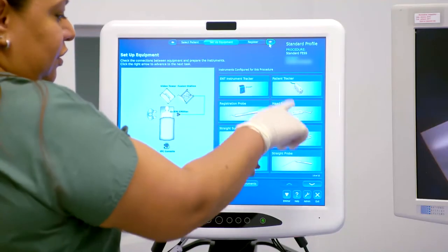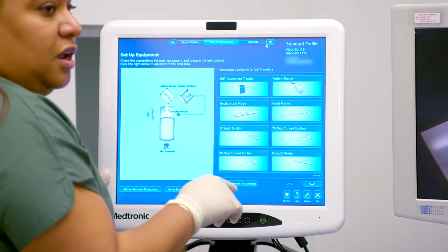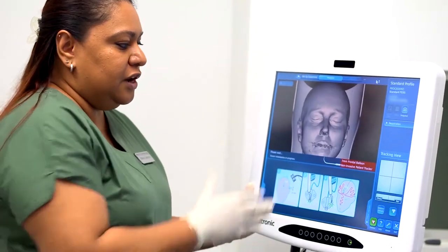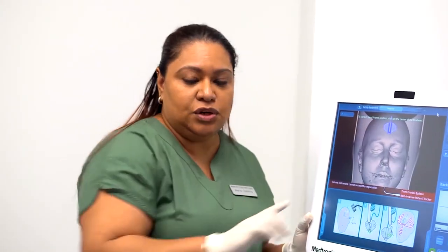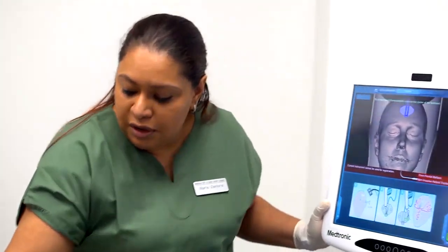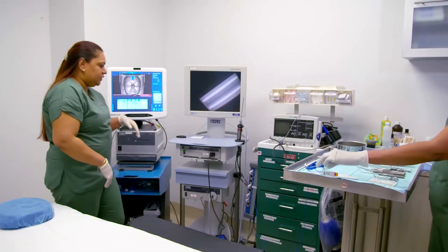And as you can see, you're going to see all the equipment that we had on our tray before. And we're just going to go next to register. And this is all set up so that when the doctor comes into the room, she'll use, as you can see, the headset. It's showing already on the screen. And the doctor will come in and register the patient with the registration tool. And we're all set up. Once Dr. Silva comes in, she'll register the patient.